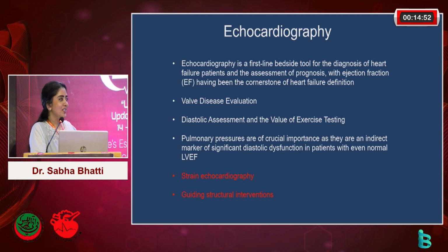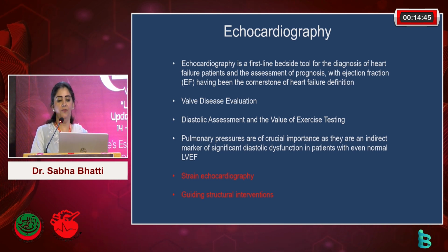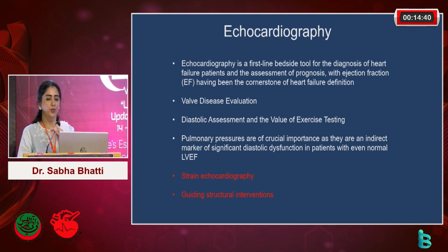Everyone knows then that it's a first-line bedside tool for the diagnosis of heart failure patients, and the assessment of prognosis with ejection fraction has been the cornerstone of heart failure definition. There's a lot of talk about heart failure at the conference this time, and so many of you are aware that you really can't do anything if the diagnosis is not made. It's very important for valve disease evaluation, diastolic assessment, as well as the value in diastolic exercise testing that is performed at some institutions. Pulmonary artery pressures are of crucial importance, and obviously this becomes a screening test for PA pressures, though it's not the gold standard.